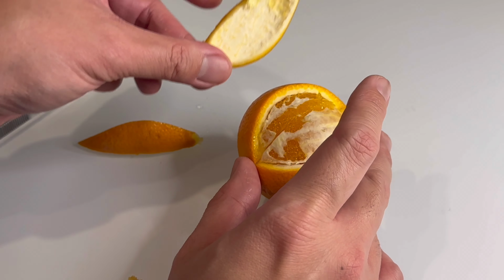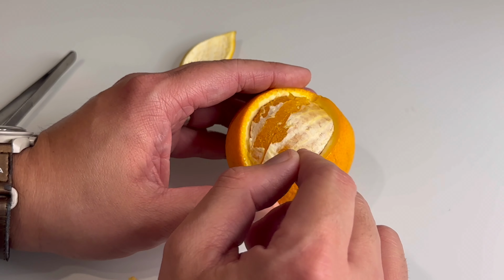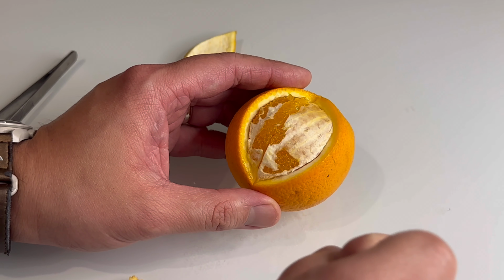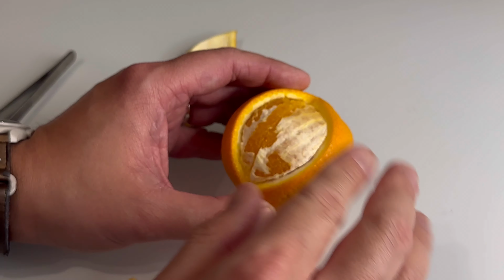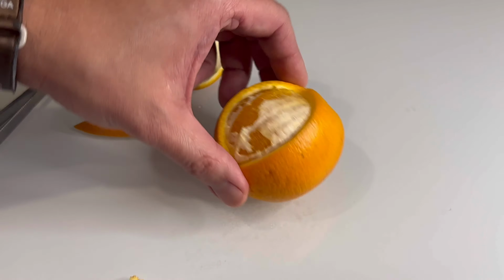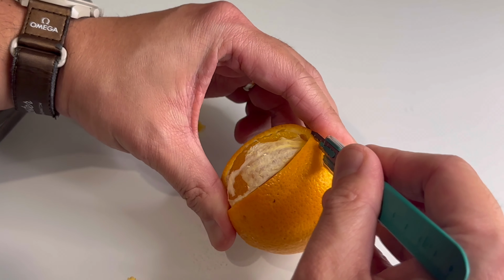And so if you want to maintain a tissue plane and or hemostasis, you want to cut and burn the vessel specifically while pulling it so that it releases the tissues above from the tissues below, and it is a controlled fashion. Let's do that one more time, understanding it better.